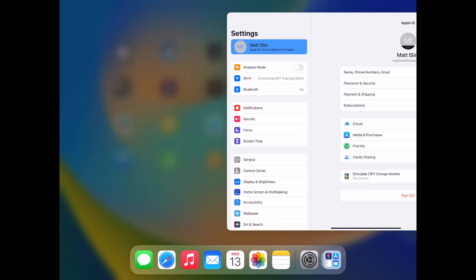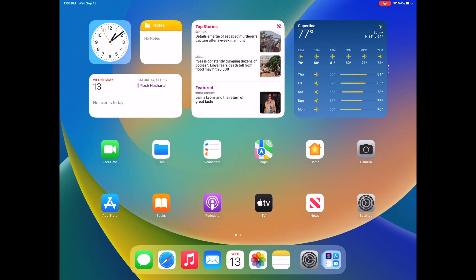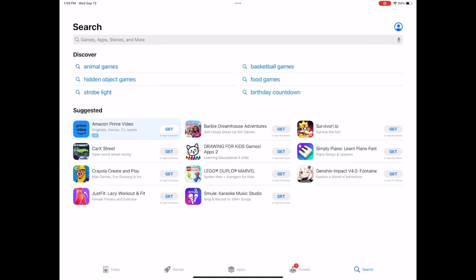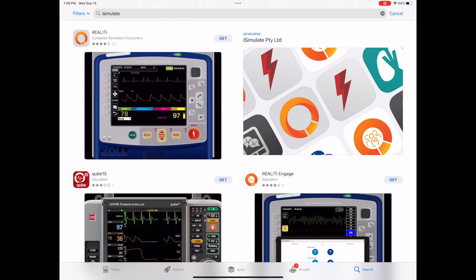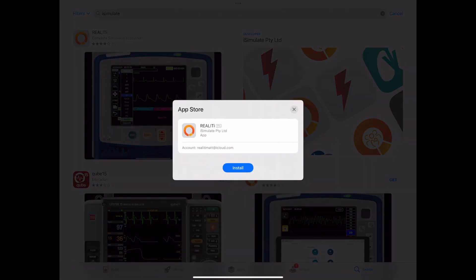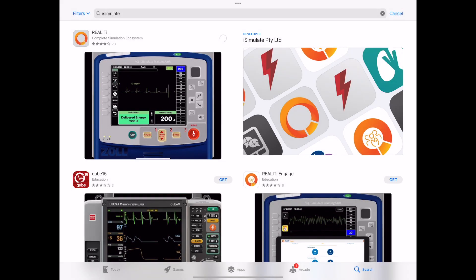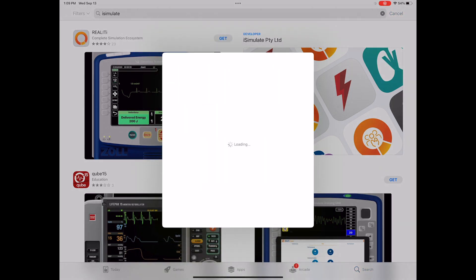Once your iCloud account is set up, close the settings menu and navigate on the iPad to the App Store. After opening the App Store, you'll accept the terms and conditions, go to the search bar, and search for iSimulate. You'll see Reality 360 pop up — select it and download it. On your other iPads in your kit, you will also repeat this process; however, rather than creating a new iCloud account, you will simply log in to the iCloud account we've just created.